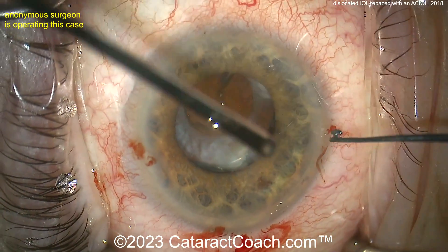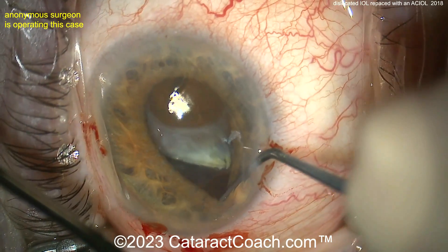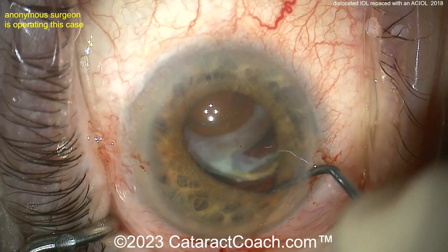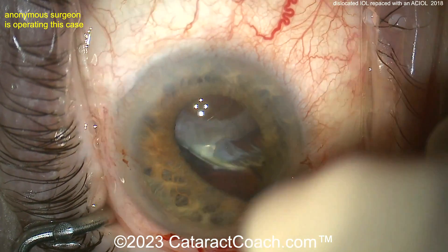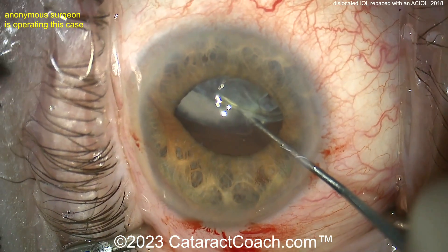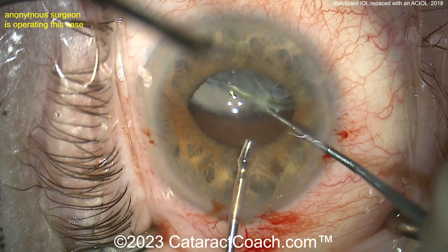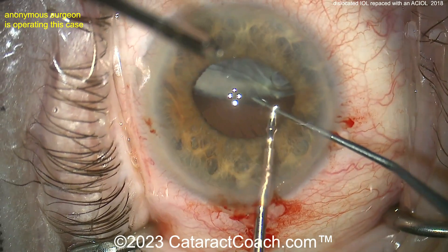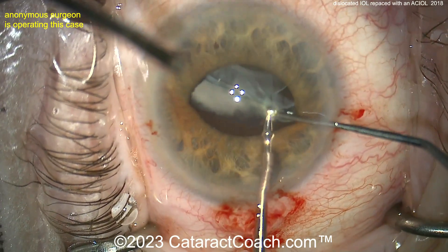The whole thing looks pretty mobile now. The surgeon is coming from above, trying to go around the IOL, but you have to wonder where that instrument is going in the vitreous cavity. You may want to do a pars plana incision to help push it up from below — that is sometimes easier. Grab with forceps — getting that up, there's really minimal zonular support at all.